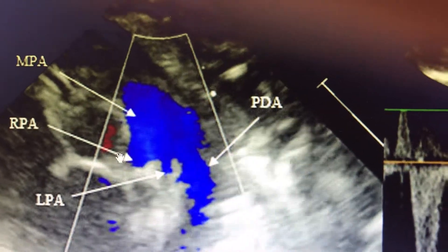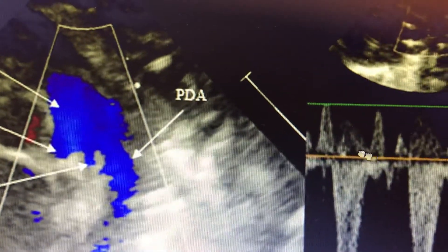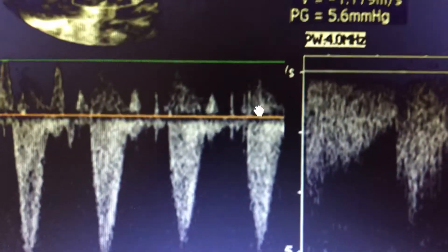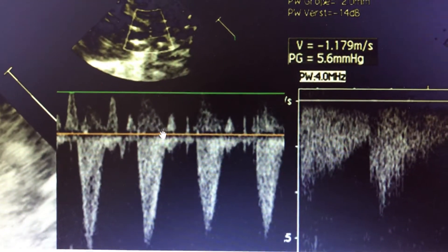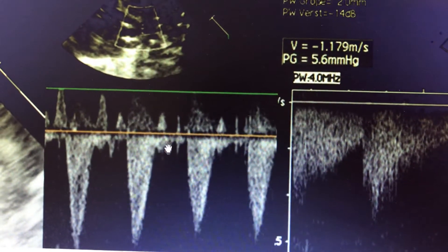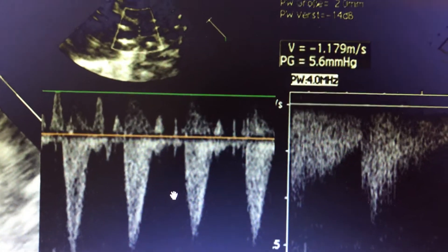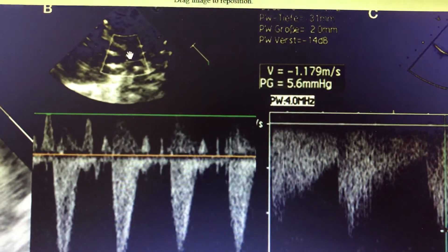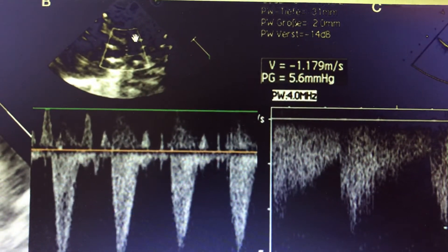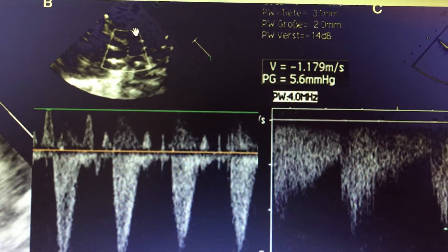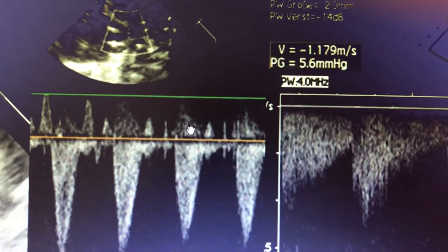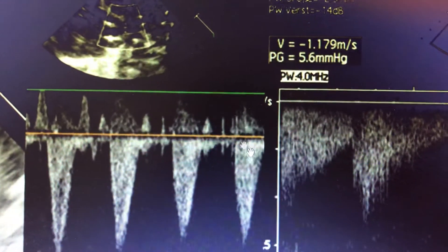This is the upper short axis view, and similarly you can get the gradients across the same. If you look at this Doppler, there is flow always below the baseline, signifying that the blood flow is away from the cursor. The cursor has been placed from the PDA to the descending aorta. If blood were coming from left to right — that is, coming towards the PDA and the pulmonary artery — this would have been positive, as usually seen in every kind of PDA.